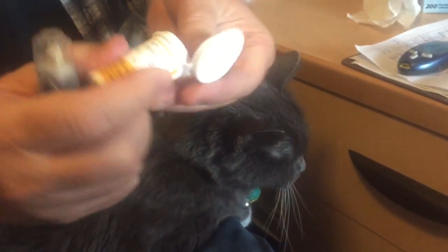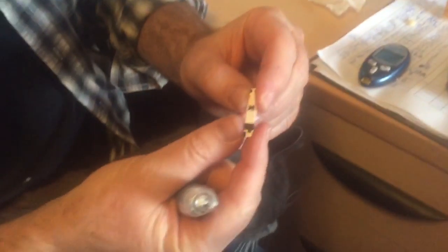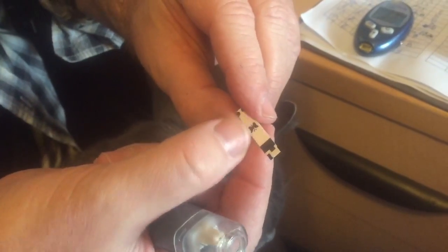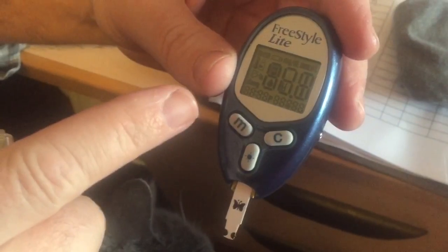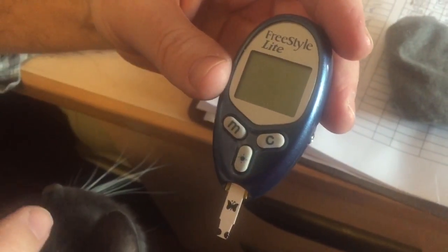Then you take out one of these test strips. Here you go with the little butterfly end — this is the testing end. This goes into the tester, this little end right here. Facing up, the tester will be turned off just like that. You pop it in and slide it until it stops, and as soon as you do that numbers will come up.